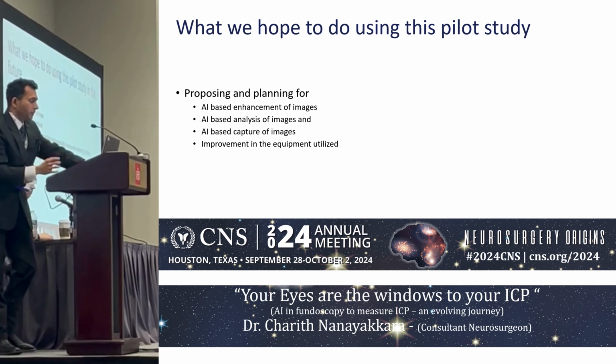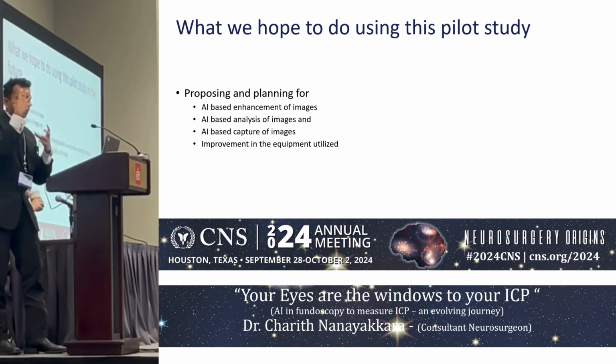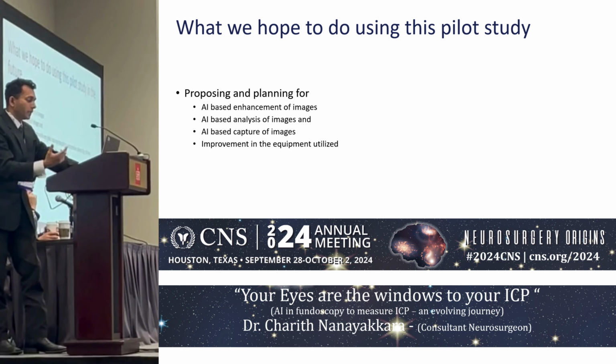So what are we hoping to do? After this pilot study, AI-based enhancement of images, AI-based analysis of images, and AI-based capture of images with eye globe tracking, especially in uncooperative patients, because sometimes it's very difficult to capture the fundus in an uncooperative patient. He's moving around, so it's very difficult. And to improve on the equipment that we are utilizing.